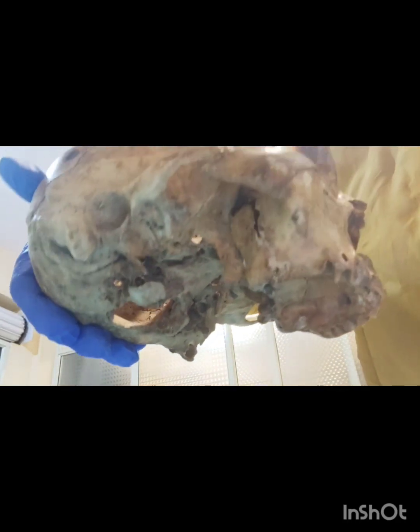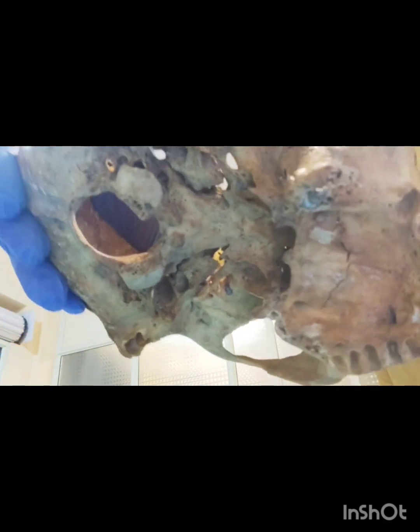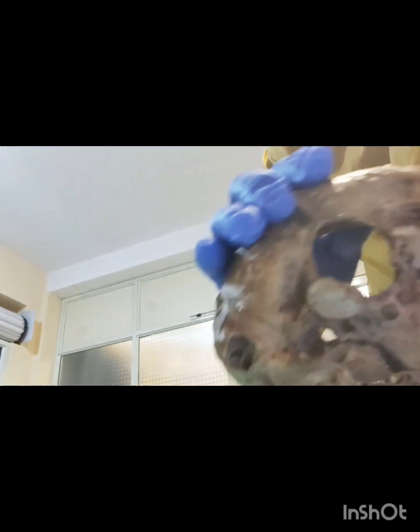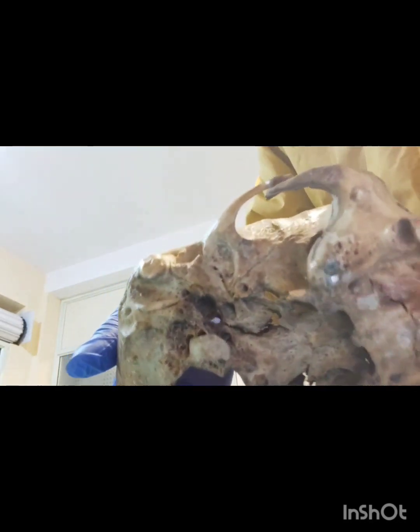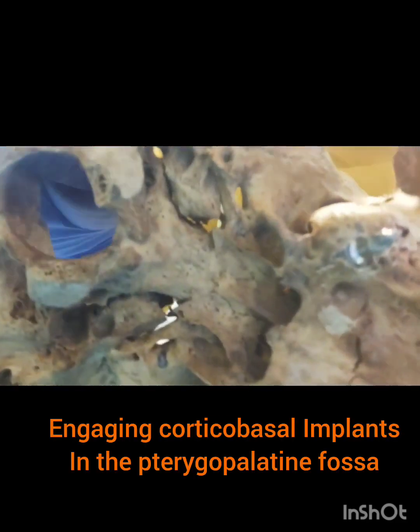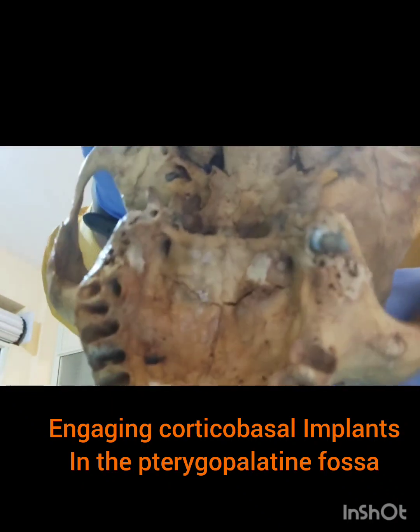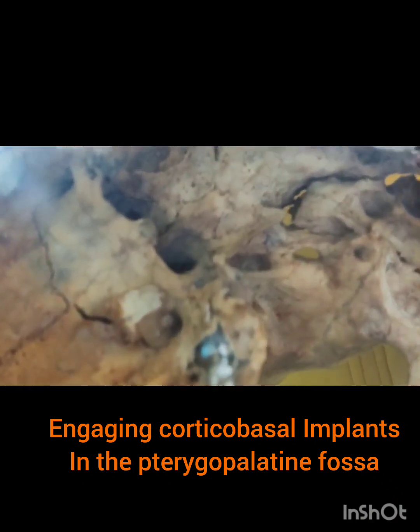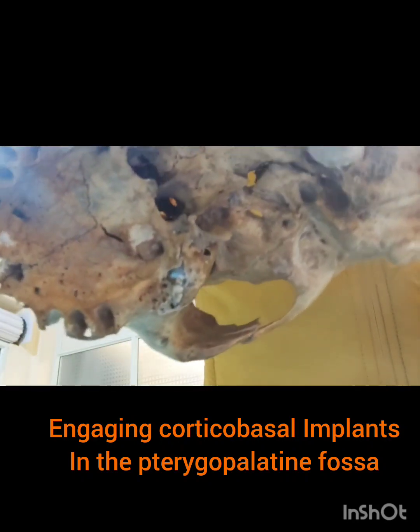So it's done. It's engaged. It's engaged. The area between the medial and the lateral pterygoid. Can I have a look?